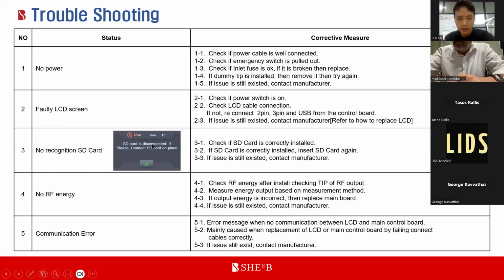Number 3 is the SD card recognition problem. Whenever you see an error code 15, SD card is disconnected, we also need to check the SD card. An SD card is inserted in the LCD panel. So I'll show you behind how we check the LCD panel.